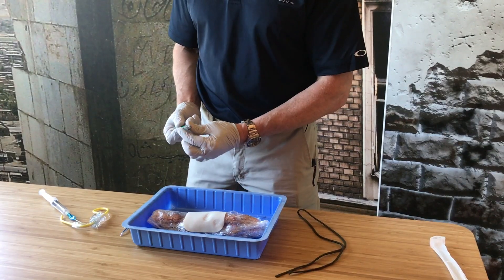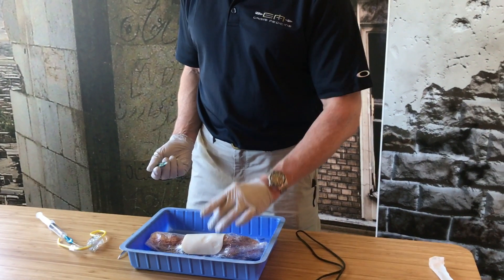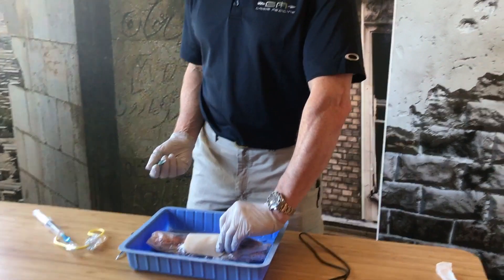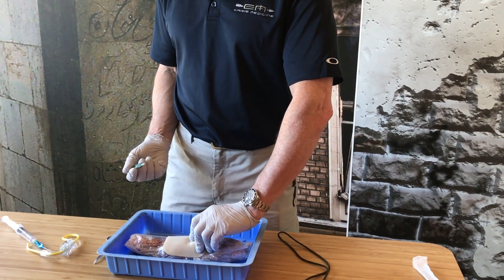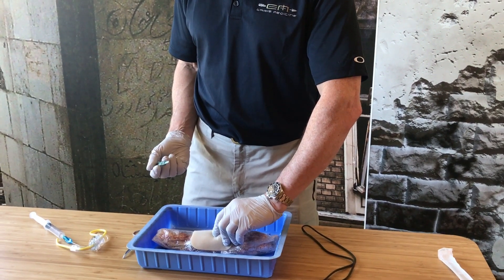Step one is I have to find my cricothyroid membrane. I use my thumb and middle finger on the thyroid cartilage. My hand would be resting on the chin and I march my way down on the thyroid cartilage until I fall into a little hole. That should be the cricothyroid membrane.